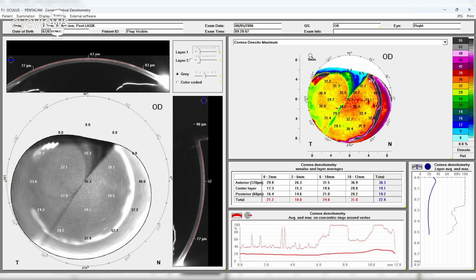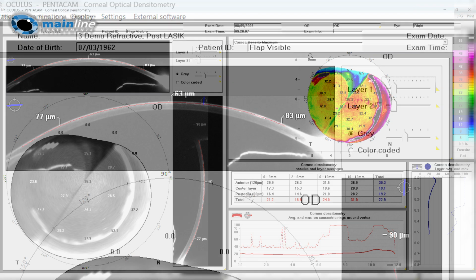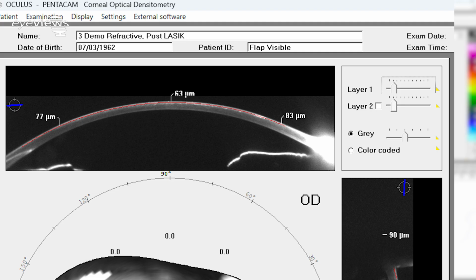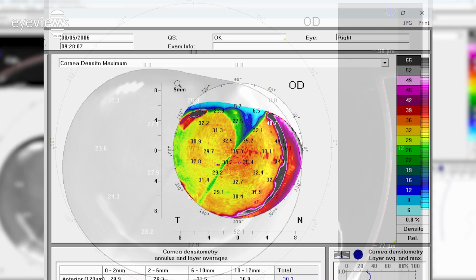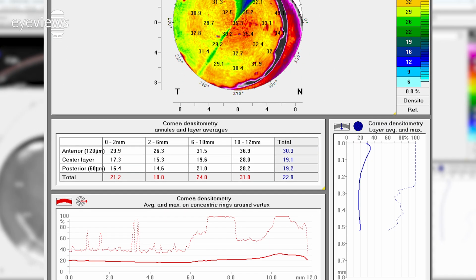When we deal with a patient with previous history of LASIK or radial keratotomies, we are dealing with a cornea where the anterior cornea surface has changed and the overall cornea refractive power is different. The Pentacam is a critical examination in order to calculate the IOL power for this patient in the preparation for cataract surgery, for any type of lens implant.